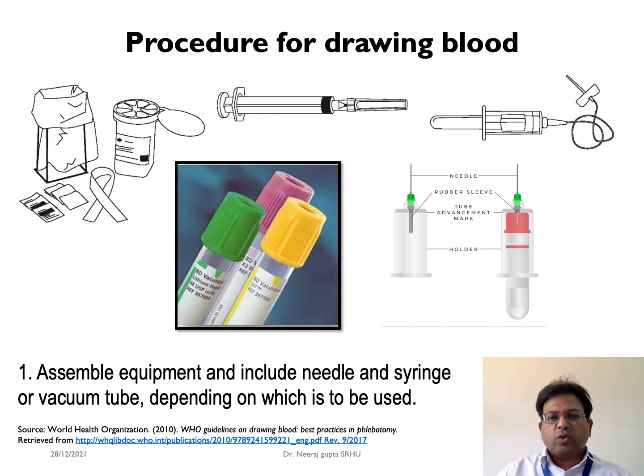Now the equipment required includes a supply of laboratory sample tubes, that is the vacuum extraction blood tubes, well-fitting non-sterile gloves, a tourniquet, alcohol hand rub, 70% alcohol swabs for skin disinfection, gauze or cotton wool balls to be applied over the puncture site after the procedure, laboratory specimen labels, writing equipment, laboratory forms, leak-proof transportation bags and containers, and a puncture-resistant sharp container.